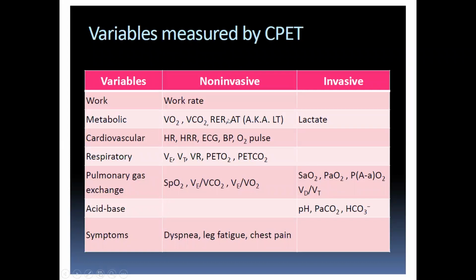It is a marker of, I'll explain that in just a moment here, but it tells you if the RER is above a particular number, it tells you if it was a good effort or not, but there are other things that the RER tells you, so we'll go over that. Anaerobic threshold, I need to explain that in a moment.